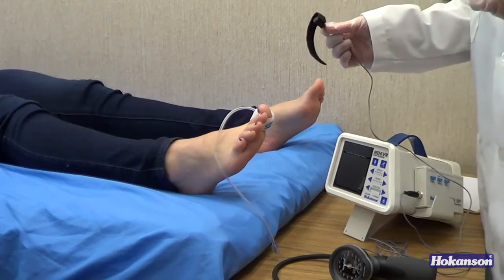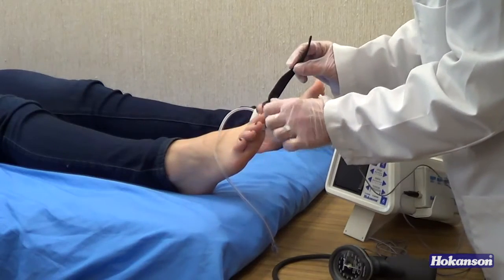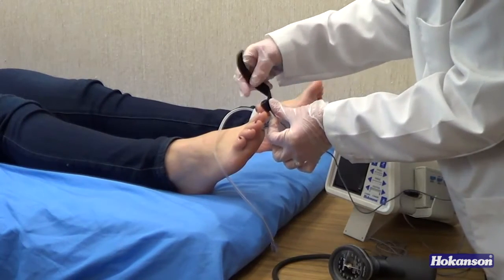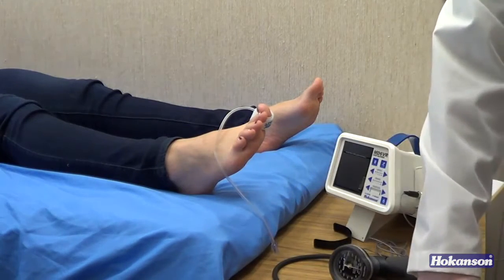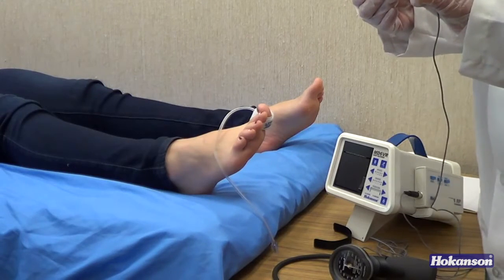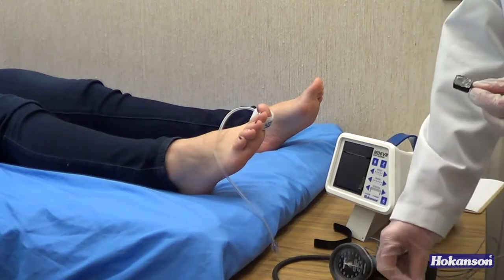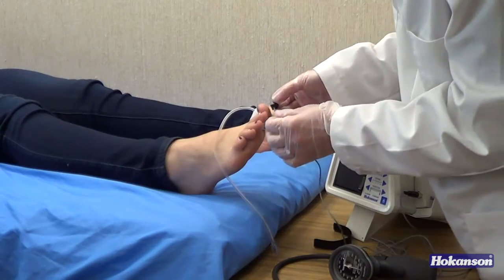Apply the phototransducer to the pad of the toe, distal to the cuff. If the Velcro strap provided doesn't work to apply the transducer without overlapping the cuff, then a piece of double-sided clear adhesive tape can be used to apply the transducer to the toe. So apply it to the transducer, and then to the toe.